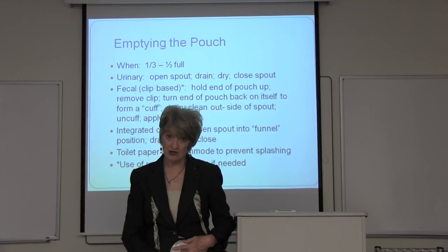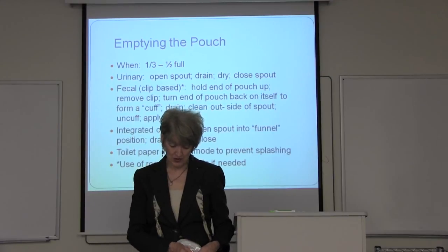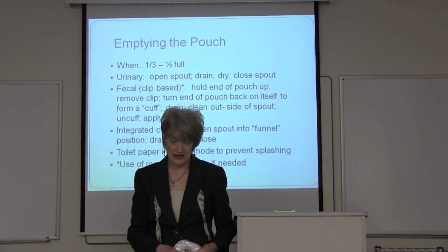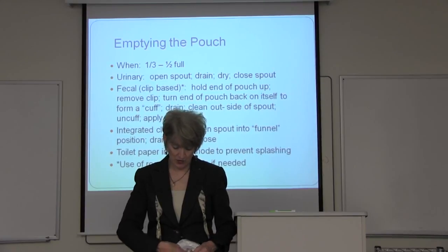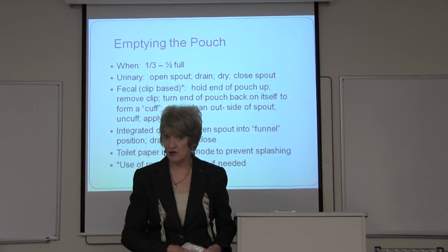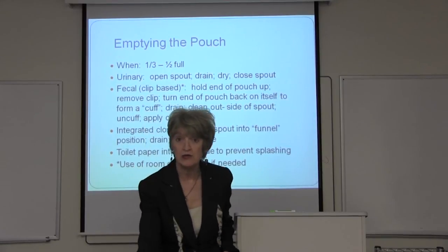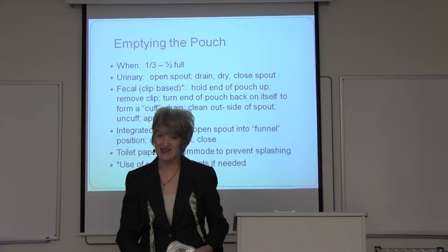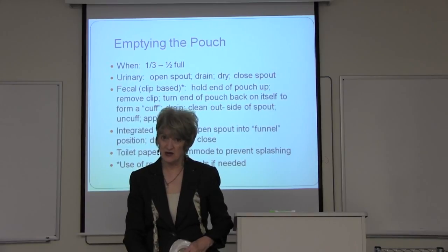Then drain the pouch. Then you can take toilet paper or a wet paper towel or wet ones, whatever. Clean the spout very well and flip it back down. So by creating that little cuff, you keep the spout completely clean. And that makes it much nicer to empty because they're not getting stool all over their fingers.